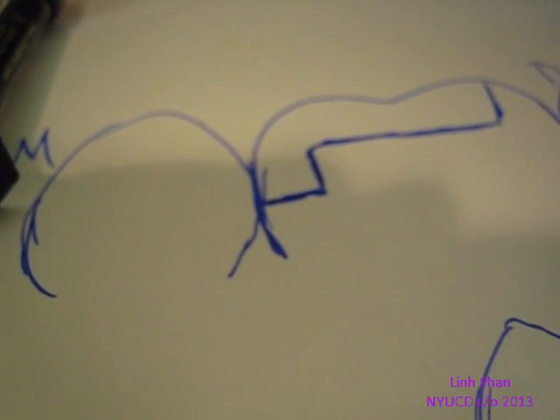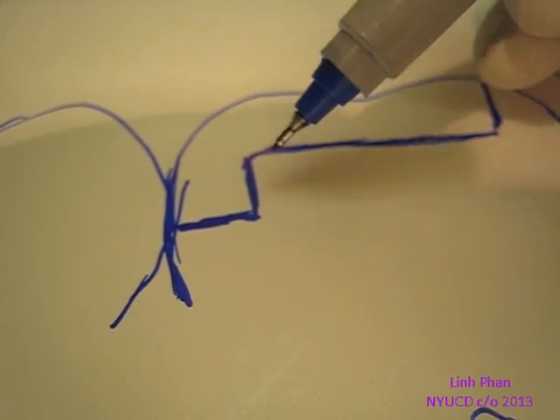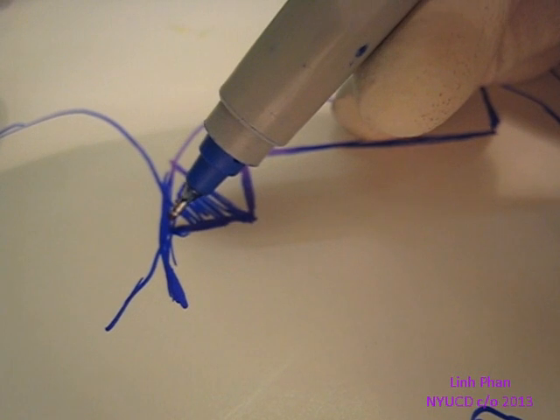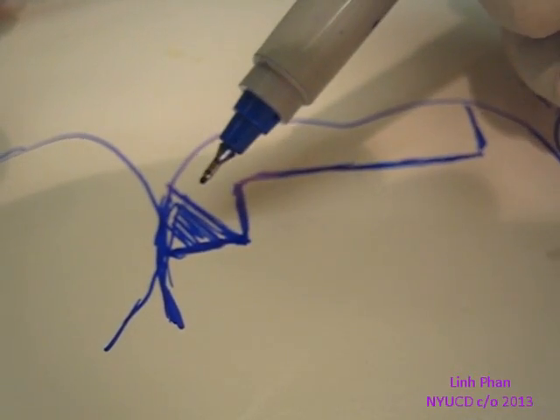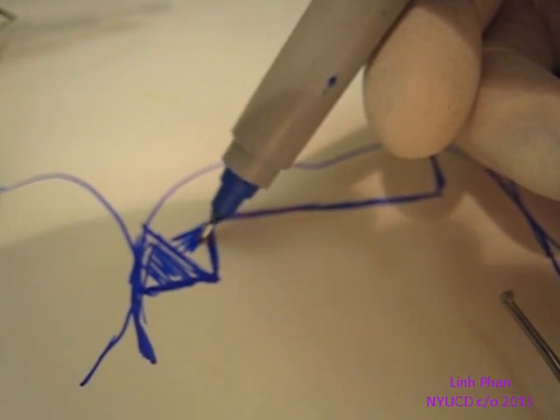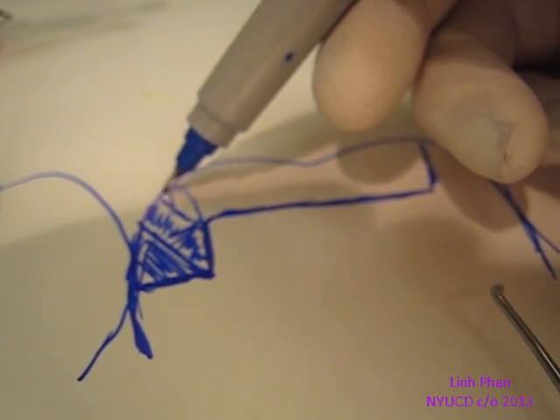So I'm going to go over what I'm going to do. Here is your prep: here's the mesial, here's the distal, here's your pulpal floor, and here's your axial wall and gingival floor. The first piece that you want to put in, you want to kind of bank it like this — fill in all this first. That way you seal it like in a real patient so saliva doesn't come up, and that way you kind of make the contact, and you have a triangle so the light can actually reach it. If you remember from biomaterials, you don't want it to shrink, and this will help avoid that. It will give it a little more strength. Then the next piece will come this way and fill this in, and then the next piece will come here, and then we'll slowly build that marginal ridge. You're doing about four steps — however many steps you need to make it.